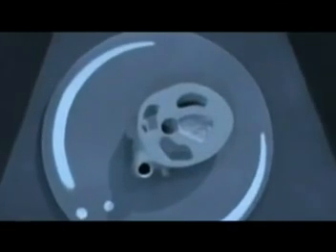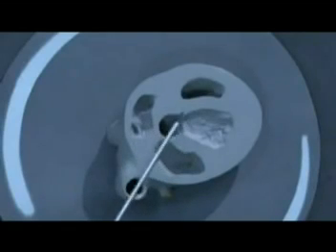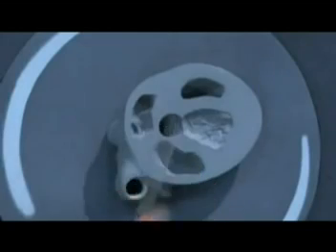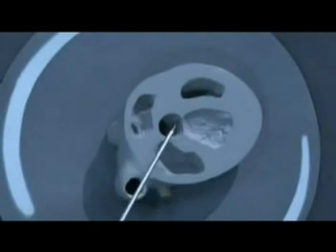When you move up the aorta, you'll see that it very rapidly, as we saw in the early illustration, turns the corner and starts to come up towards the fetal head. Therefore, what was a structure looking like a tube now becomes a circular structure as it is cut in cross-section. In this case, we can see that the spine is down on the bottom left of the screen, which means that the baby's head is into the screen. The left side of the baby is on the right side of the image, the right side of the baby is on the left side of the image, and the aorta in the centre here can be seen having turned the corner and started to go up towards the head.